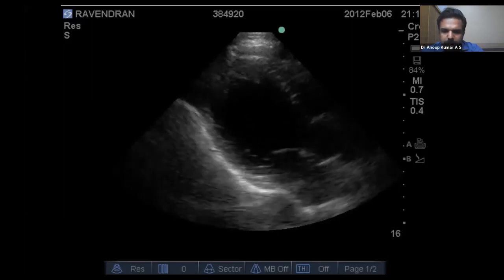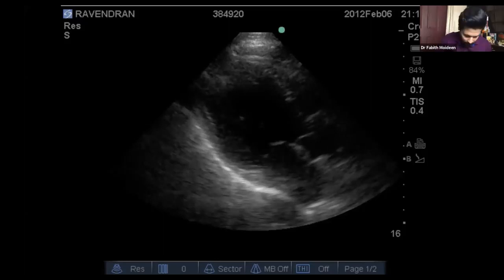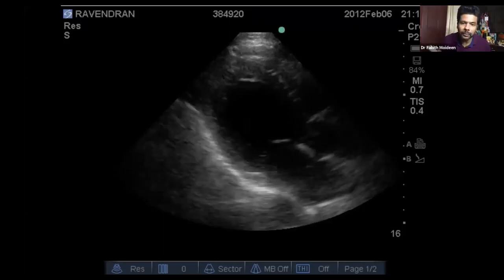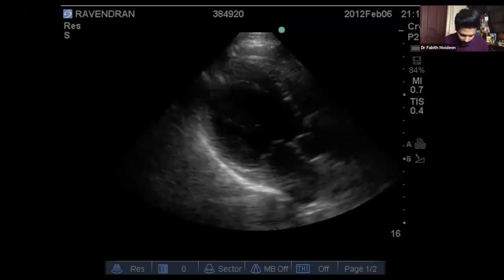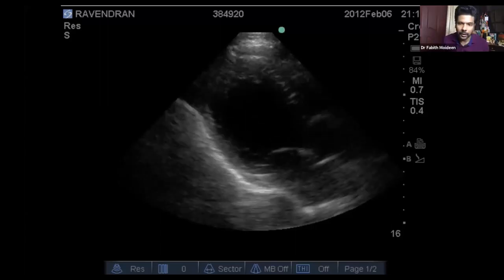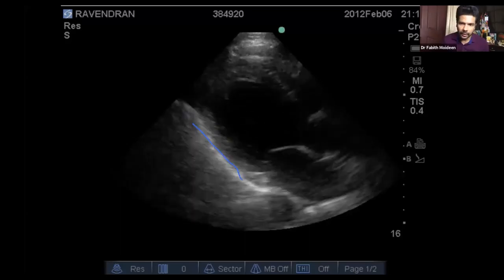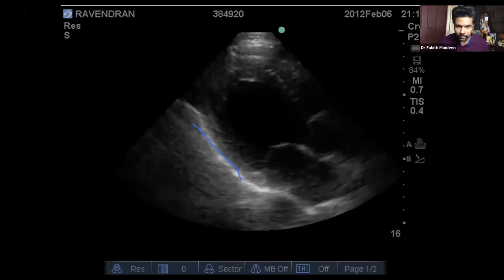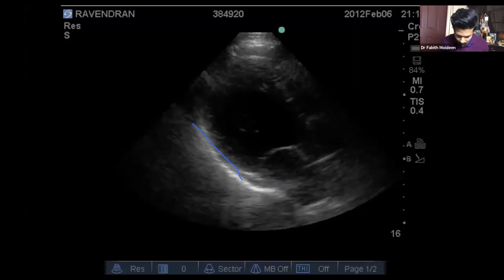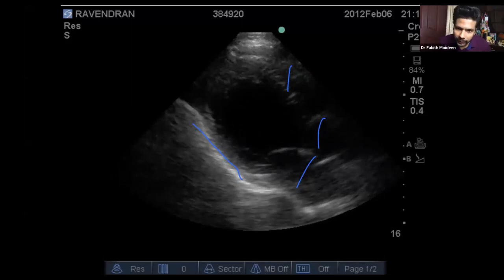People are typing. I just want to tell you, outside you look at the pericardium. First is what is the view. You'll all agree with me that this is a parasternal long axis, okay? And you can see the pericardium. So that's clear. There is no fluid around the pericardium. Second thing is rule of 3. Apply a rule of 3. Your RV to aorta to LA, almost the same size, okay? So there is no problem there.